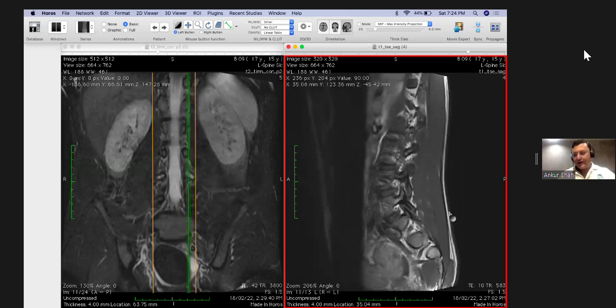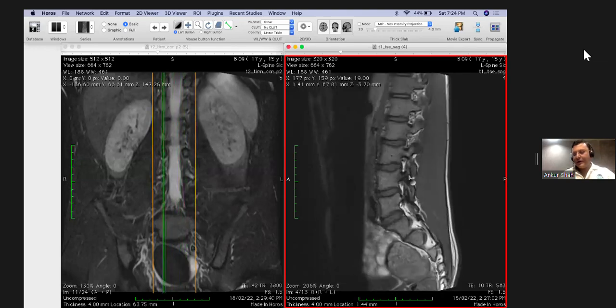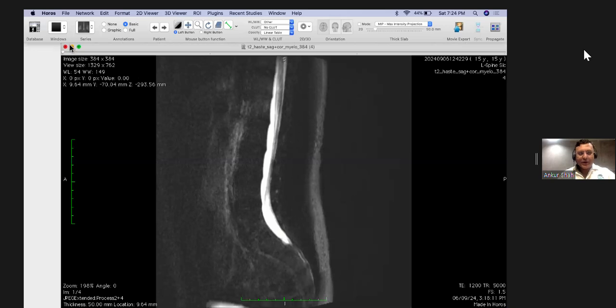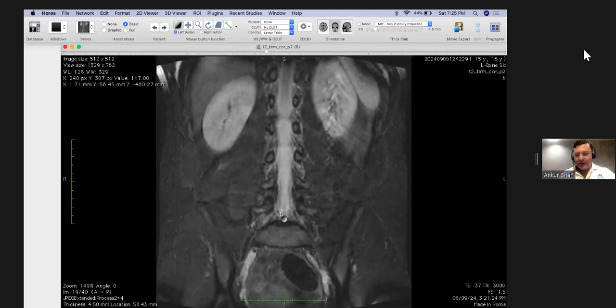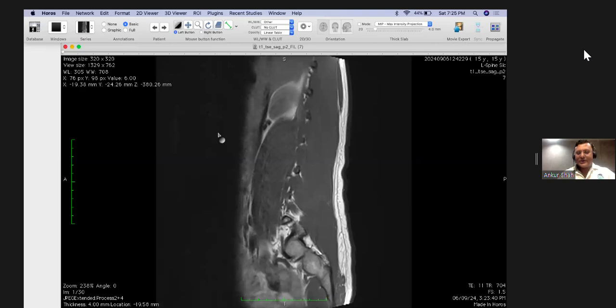Now you can see very clearly there is hypointensity of the pedicle on both sides at L4 level, and that is the acute stress injury, which results in severe pain. Sometimes even CT scan also helps in detecting these subtle incomplete fractures in these players whenever they are there. I'm just showing you subtle changes. Again here, if you compare left and right, on the right side it is showing a subtle area of marrow edema. So all these changes may not be very obvious, but we need to look carefully, particularly in the players, to detect these areas of acute stress injury.